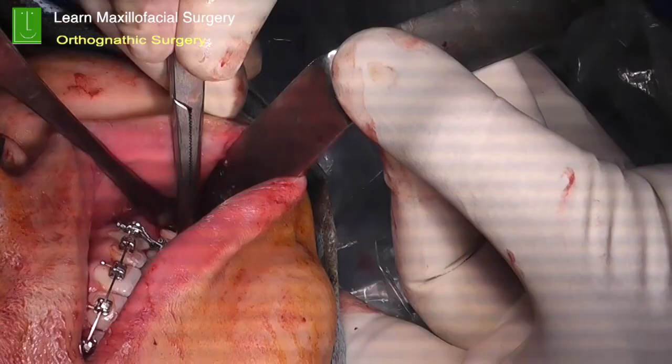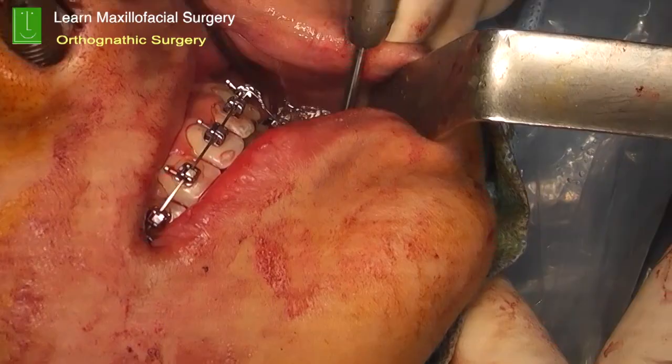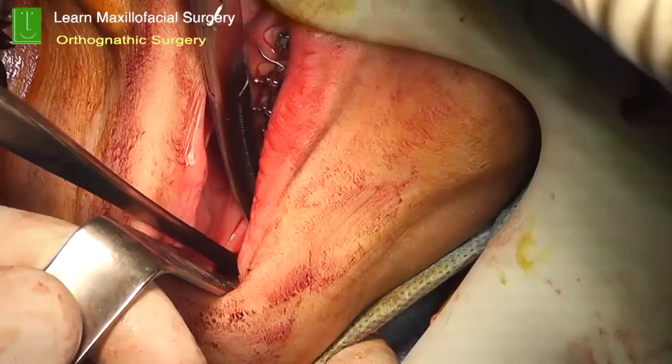Choice of fixation is either to use position screws. Generally, we don't use lag screws here, but the position screws are also useful. But my personal choice is to use a four-hole single plate on either side, right? And that's what we are doing.